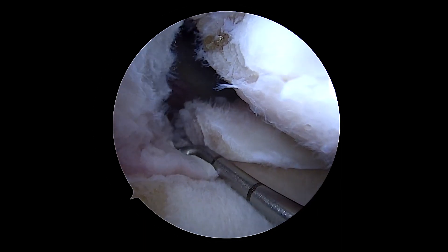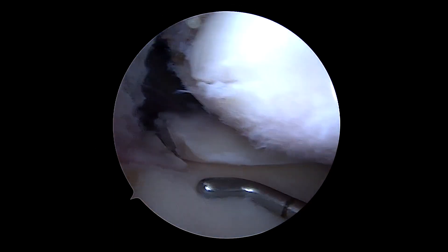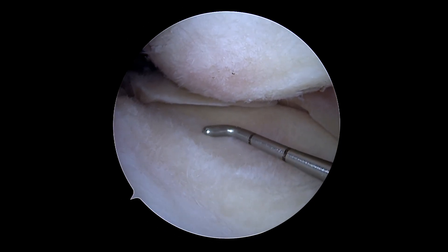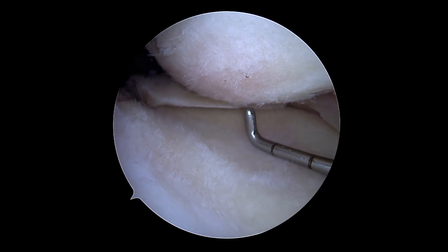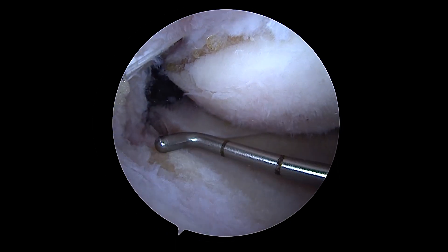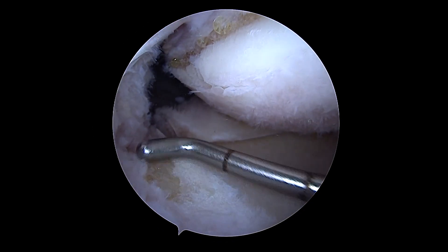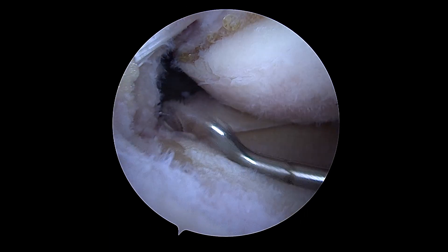There are a few important visualization tips because you can't fix what you can't see. We've lengthened the MCL — we've taken a spinal needle and pie-crusted the femoral side of the MCL at about 20 degrees of knee flexion and valgus. You can see we have a little bit more opening than normal — not trying to create a grade 3, but maybe a grade 2 MCL opening. We've also taken the power rasp and taken down the medial tibial spine. This provides some visualization to the back, provides some bleeding bone and biology, and helps the guide sit a little bit flatter so you don't have that big upslope of the tibial spine.